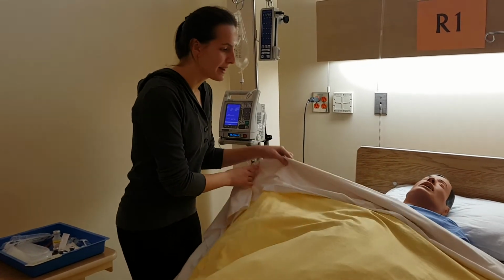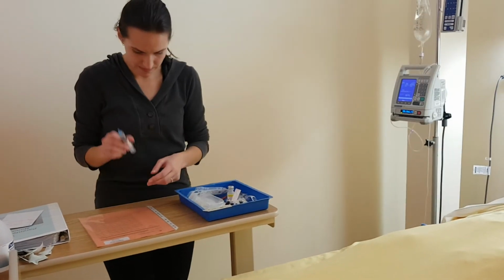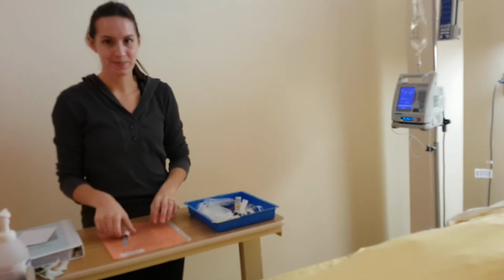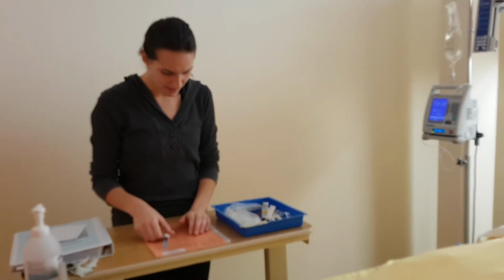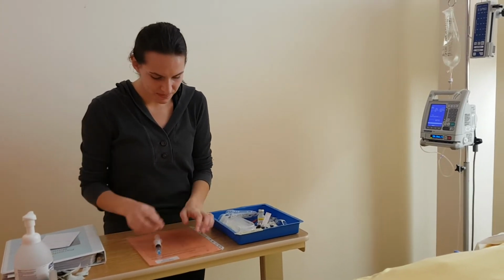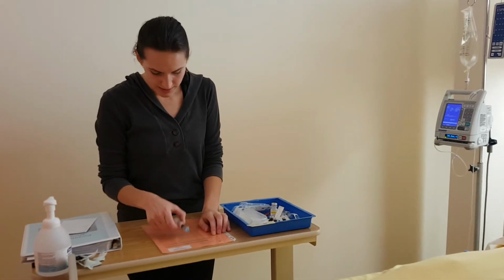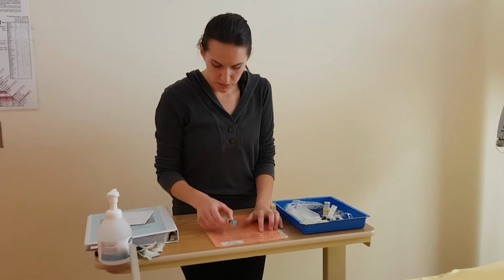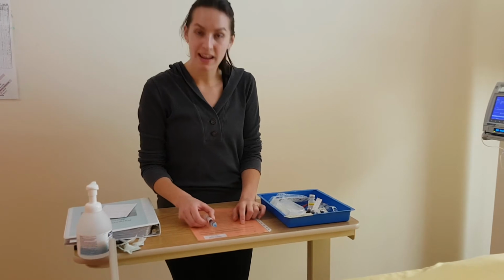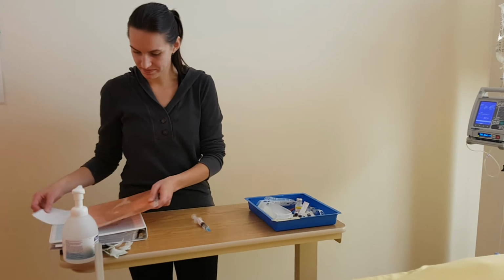So I'm going to do my third medication check before I prepare my medication. So I am comparing my syringe to my MAR. Okay, so I have here that it is the correct patient, which I've identified. Allergic to morphine, make sure of the correct dose. Lasix, correct drug, furosemide, 40 milligrams, which I have in here, 40 milligrams, given IV, and given now, the correct times. So I've done my medication check. My second check with my vial.